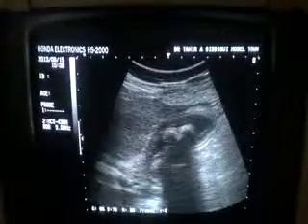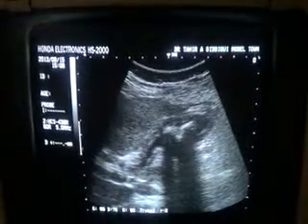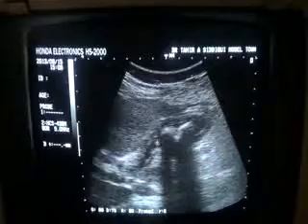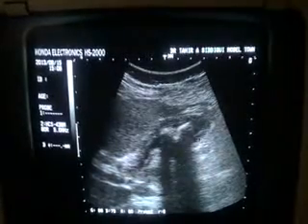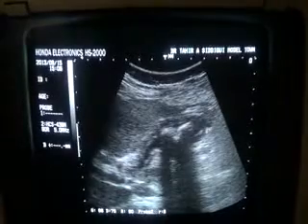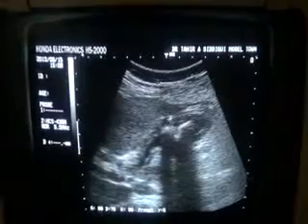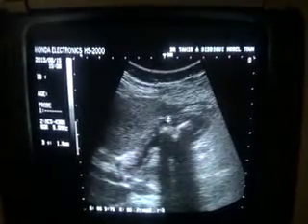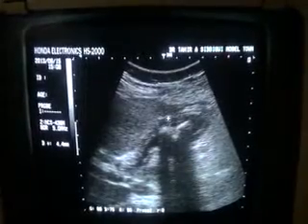The patient is fasting overnight, and we do see that the lumen is collapsed and a small amount of bile is seen over here. These are the calculi, this is the fundal region, this is the posterior wall, upper part of the posterior wall, and this is the anterior wall. This wall measures approximately 4.4 millimeters and is enlarged.